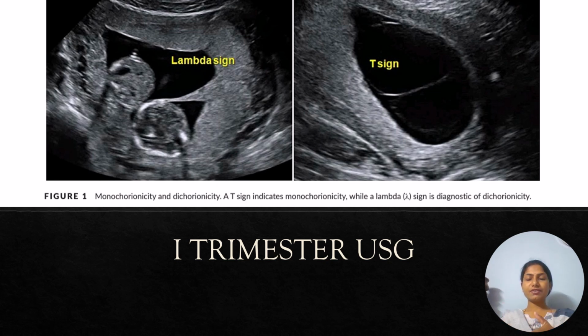So in the late first trimester, we have to be able to visualize two fetal heads or two fetal abdomens, or anything like two fetal heads has to be visualized in a single frame on an ultrasound to confirm a twin pregnancy. So sometimes when we are scanning with a probe, we might see one head, and then if you manipulate the probe, we can see the other head.